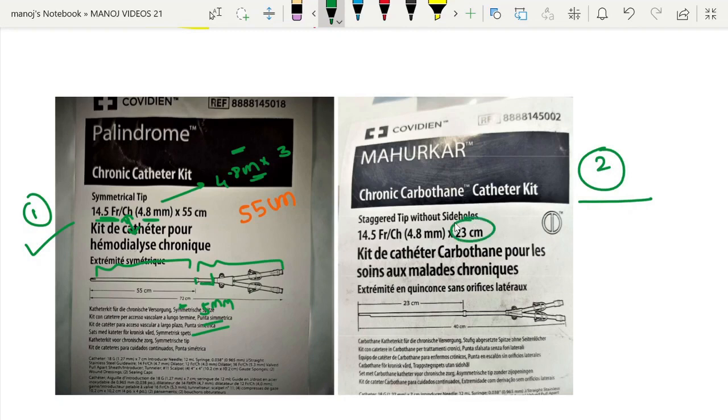Second is the 23 cm perm cath. This belongs to the Covidien company. Again it is 14.5 French. Here the tip to cuff is 23 cm. Here again it is 17 cm. So the total length is 40 cm, 23 plus 17 cm.